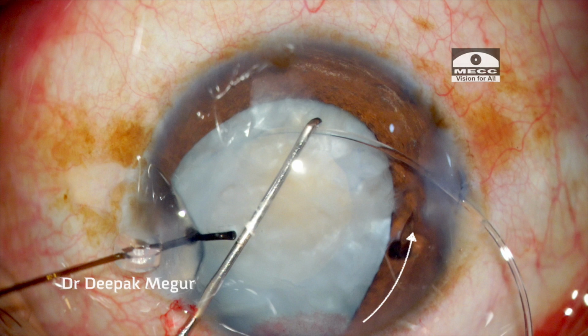On the contrary, if we introduce the ring the other way around, during further manipulation there is a higher chance of further damaging the adjacent healthy zonules, and that's the reason why this should be avoided.